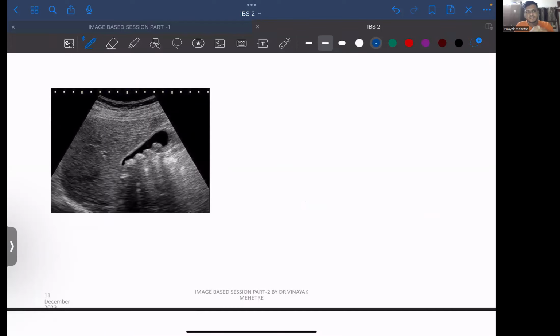Patient presented with AST, ALT deranged, jaundice. Okay, ultrasound is done. There is pain in right upper quadrant with AST, ALT deranged. Okay, winter है अभी इस टाइम पे. All of the people who are living in Delhi, they are eating fatty foods, right?